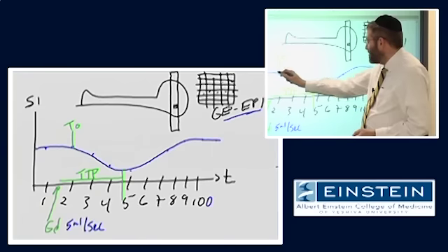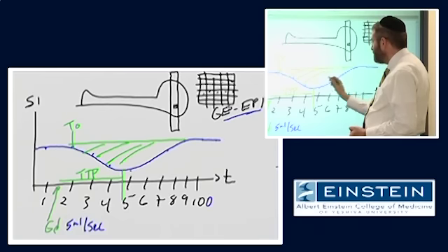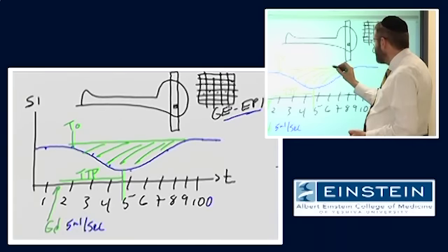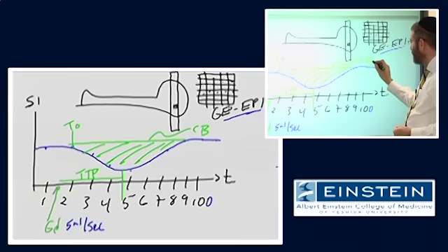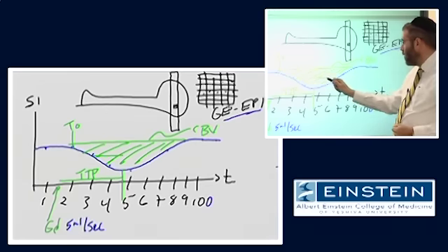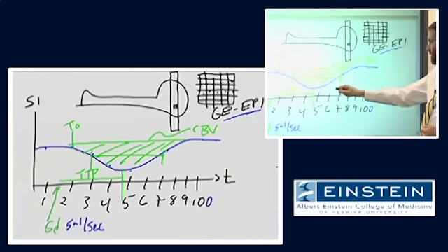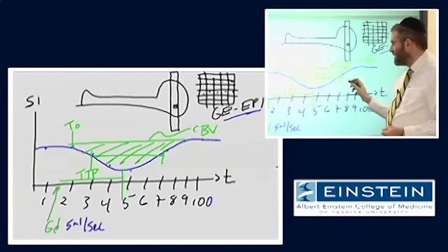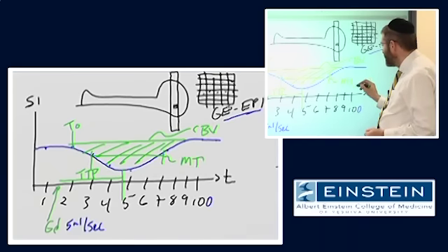If we take the integral of this area, this is proportional to the intravascular volume of contrast, or what's called the cerebral blood volume. And if we take an estimate of the width of this deflection in the time signal intensity curve, this is called the mean transit time.